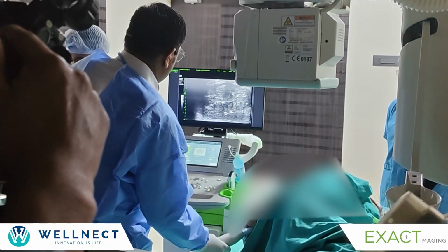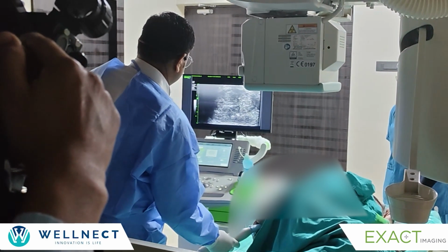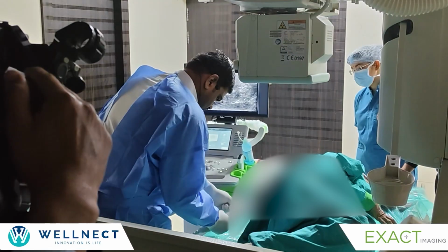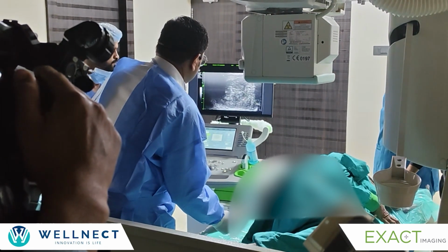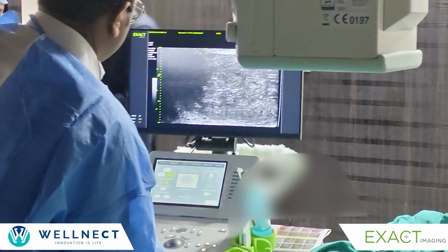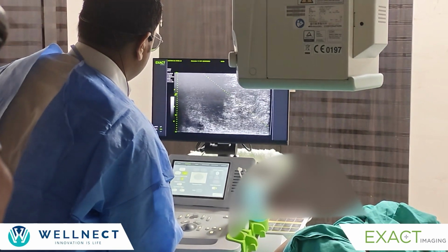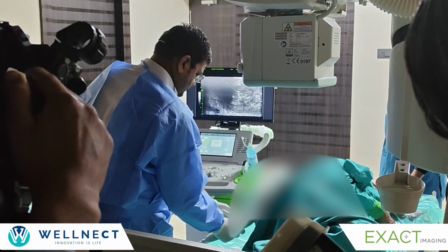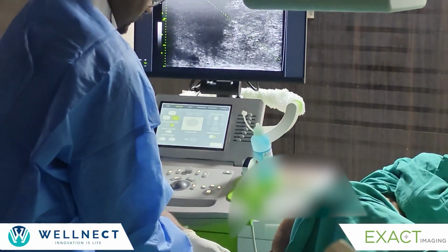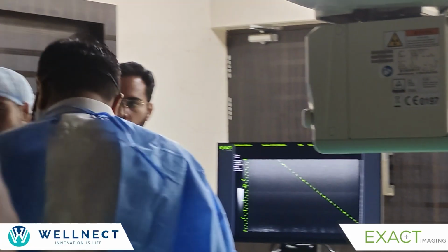Now again, mid gland, right lateral. Lateral, and then the base. Lateral, base, right side. While we change the probe, one thing we understood right now.